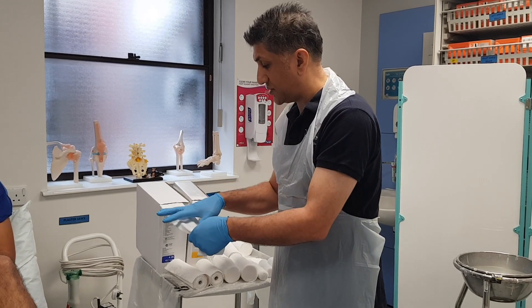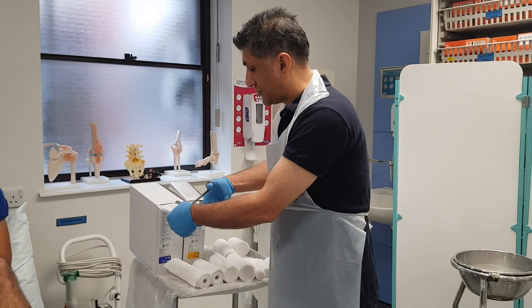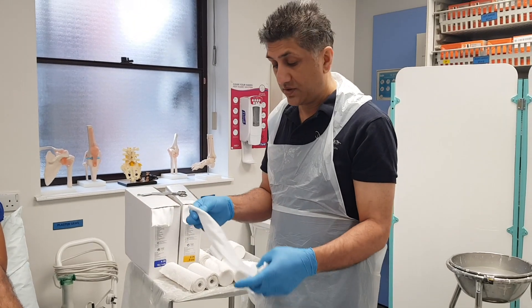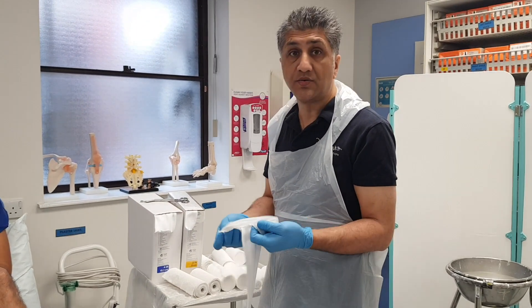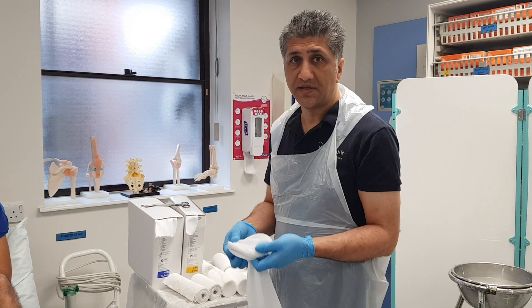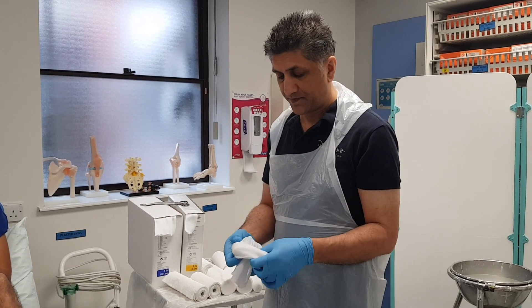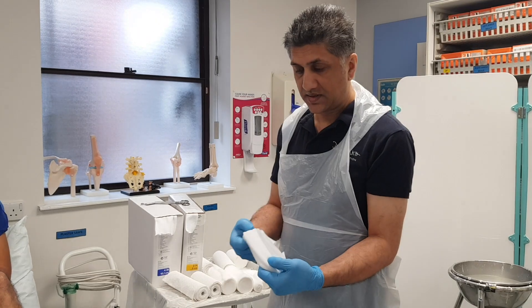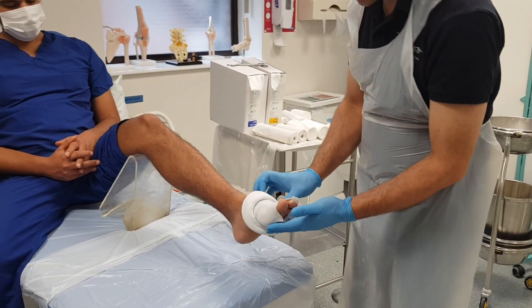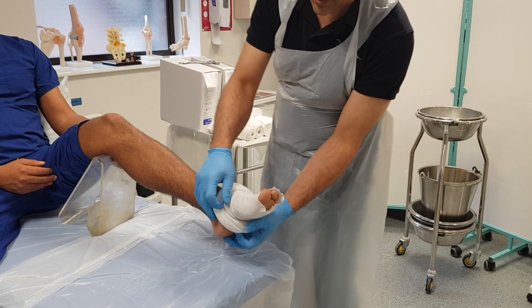It's better to have too long than too short. This is one way to do it with the patient in a supine position — so if you have sedated your patient in order to manipulate the ankle, this is how you do it. Now with our stockinette, because there's an injury I don't want to drag it on — I want to unroll it and go all the way down to the metatarsal heads, unrolling it around the foot.